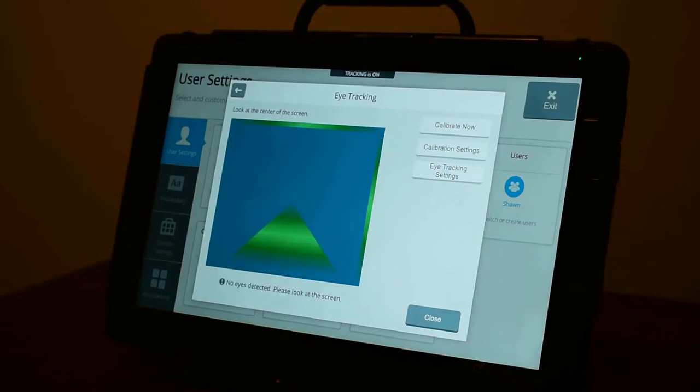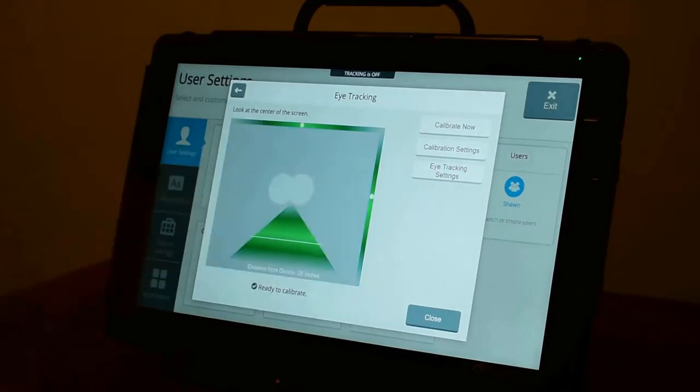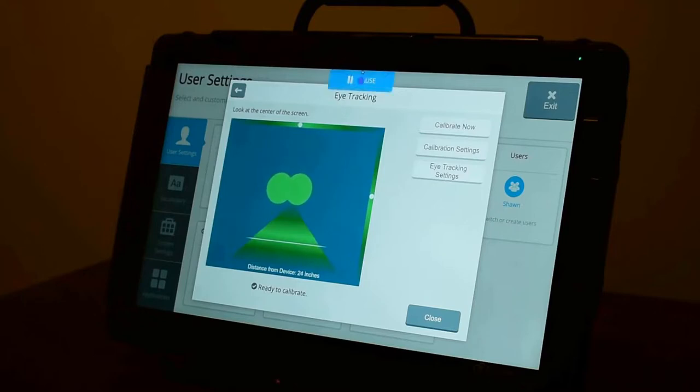To pause the tracker, you can click on the blue box, or you can use the drop down at the top by simply looking at it to resume your tracker or pause it.